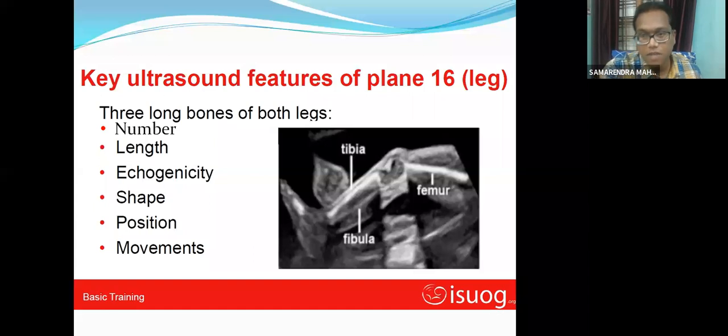First of all, this single image shows that the lower limb is present, number one. Number two, all the three segments are present. Number three, all the bones, that means the femur in the proximal part, tibia and fibula in the middle, and the metatarsals in the foot are visible.